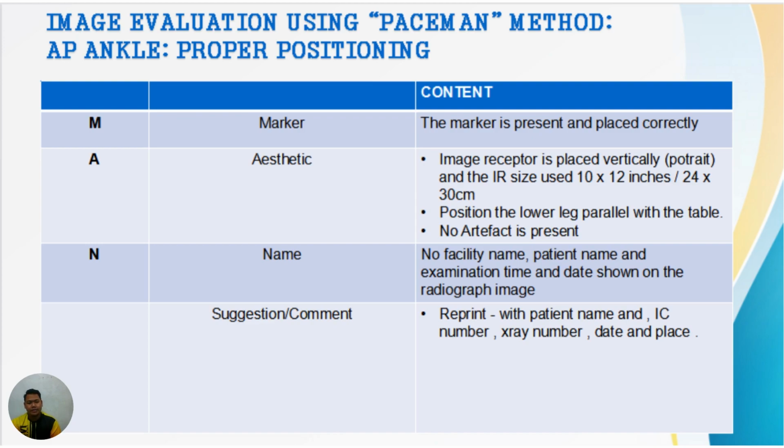The next part is M, which stands for marker. Marker is present and placed correctly. On this particular image, we can see there is a right marker visible on this image.